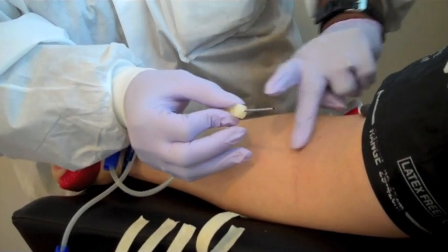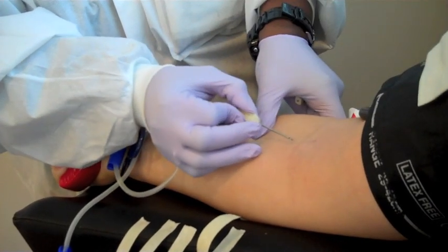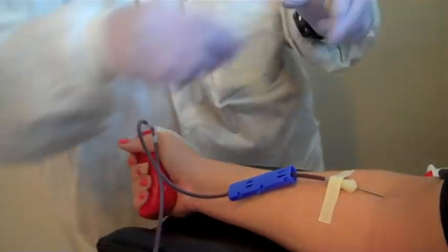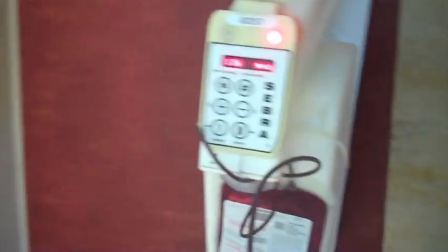She warned me there'd be a big stick and a little stick. As long as I keep squeezing, she says I'm going to do pretty good. So here I am, donating blood. It's going to take a little longer for me to fill up the blood bag sometimes, but I think it's worth it. I think it's important — that's why I do it.